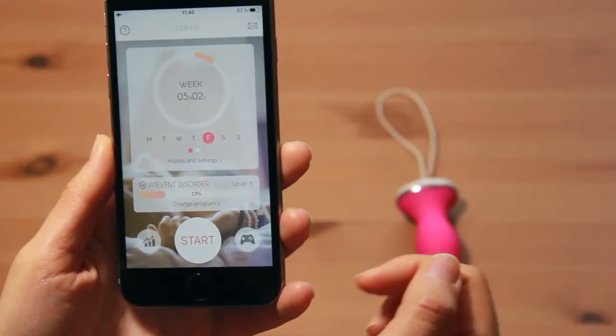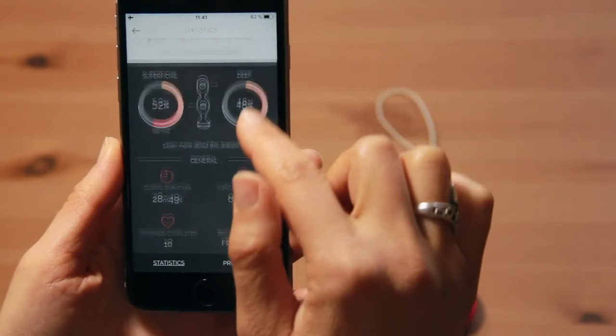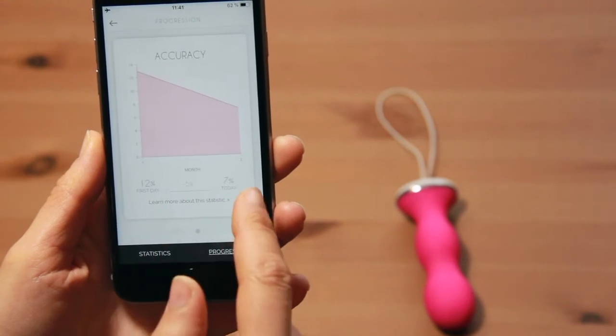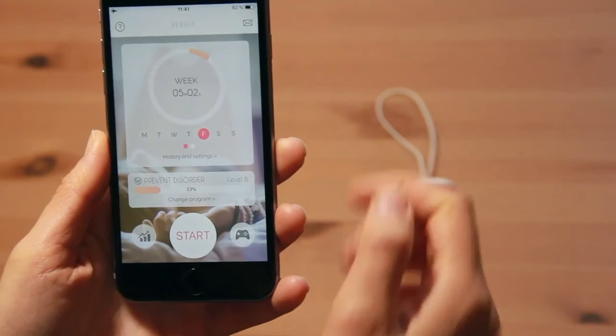Finally, you will be able to see your daily progress and stay motivated, as your pelvic floor statistics are easily viewed in the application. You also have access to insightful details about your perineum, as well as statistics to follow your progress in each particularity of your training.